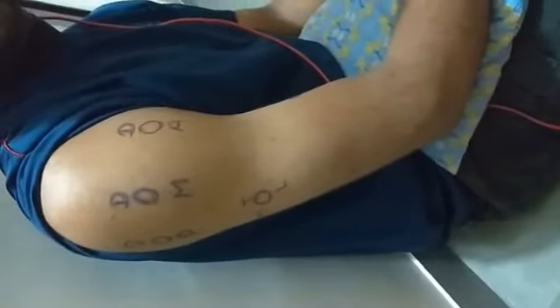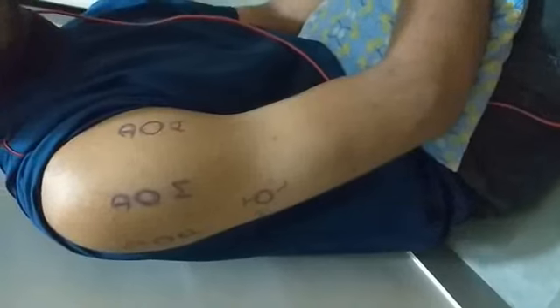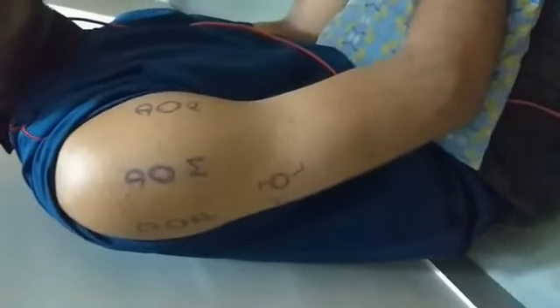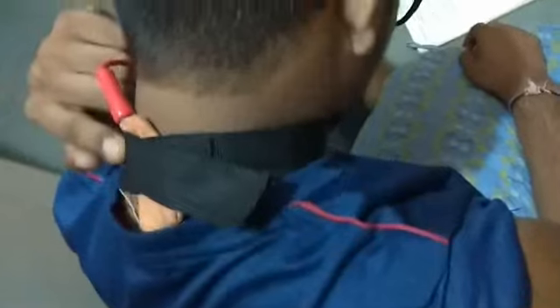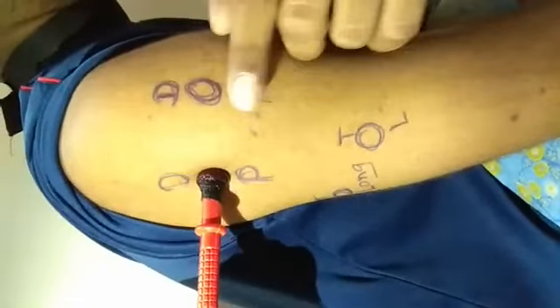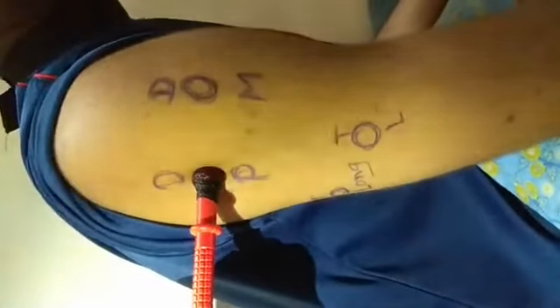The axillary nerve supplies the deltoid muscle: anterior fibers, middle fibers, and posterior fibers of the deltoid. For the axillary nerve, the reference electrode we can place at the C7 cervical spine. This is the C7 cervical spine for the reference electrode. This is the motor point of the anterior fibers of the deltoid. Good. This is the motor point of the middle fibers of the deltoid. Good. This is the motor point of the posterior fibers of the deltoid.